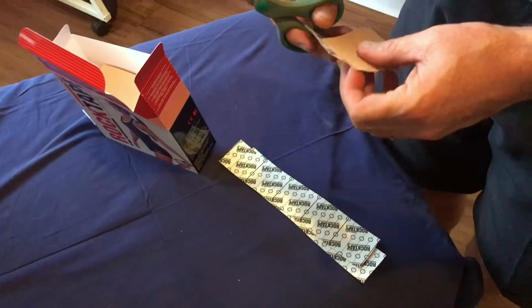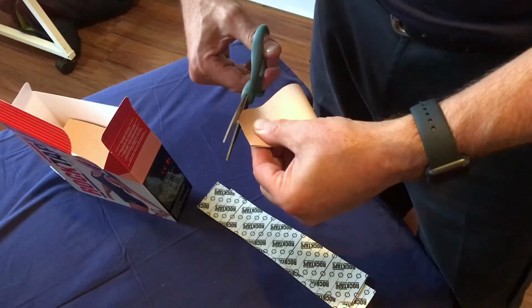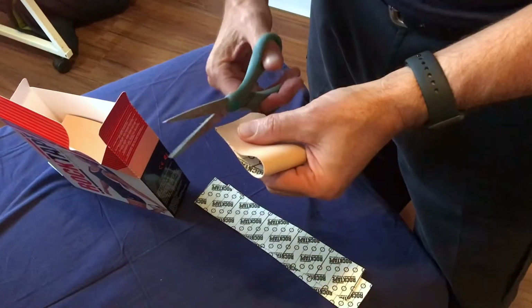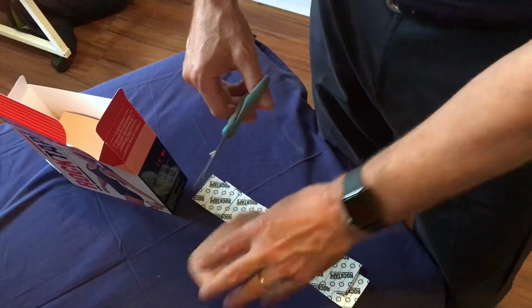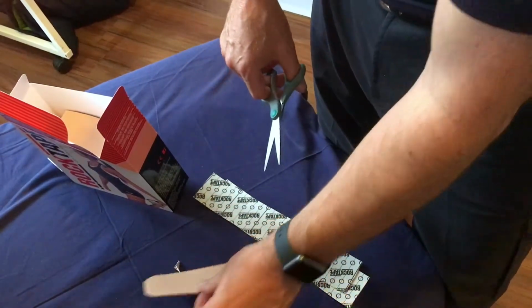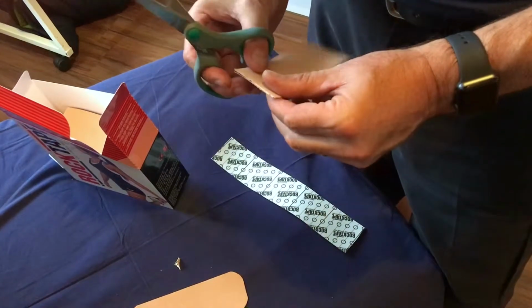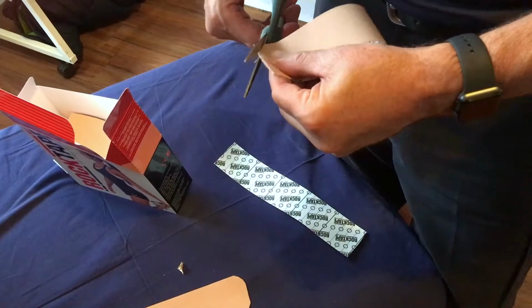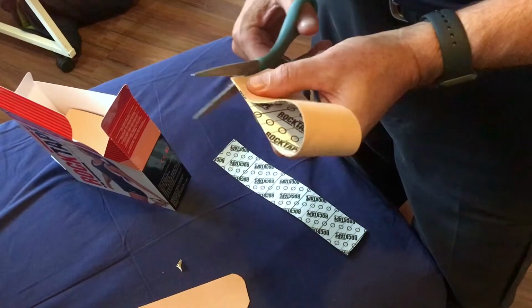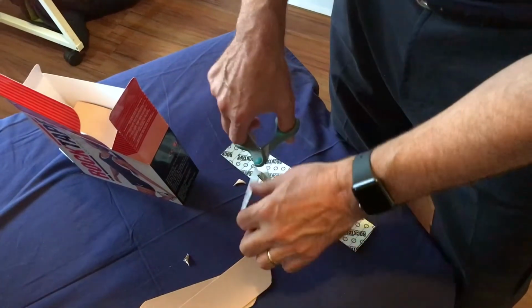The next thing you need to do is actually prepare the tape by cutting the corners off and rounding them off. This is because the adhesive in the tape sticks well to skin, but once it lifts it doesn't stick back down again very well. So if you've got a sharp corner or a square corner, it's a lot easier for it to lift. When you cut the corners off, it basically stops it from lifting from the corner, because once it starts to lift it tends to keep lifting.